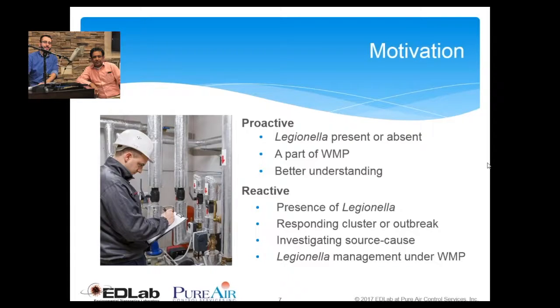In that situation, we have to work in a reactive mode to get the information as quickly as possible so that the investigators or evaluators can determine the source and cause, like where this source, meaning Legionella, is coming from and whether the causative outbreak or cluster is associated with it or not. So that is very important and valuable information.